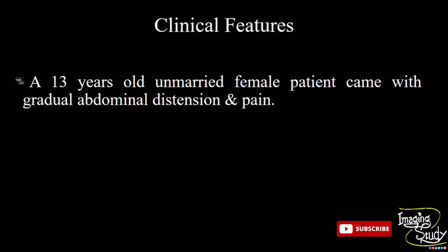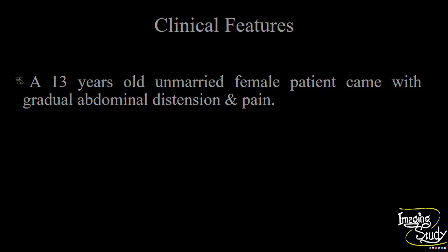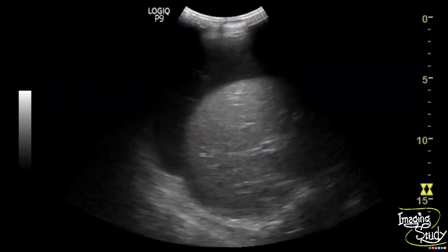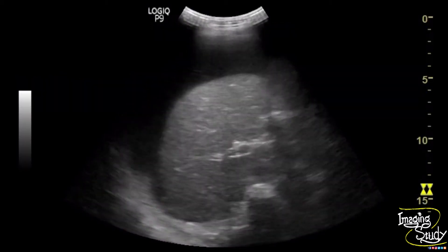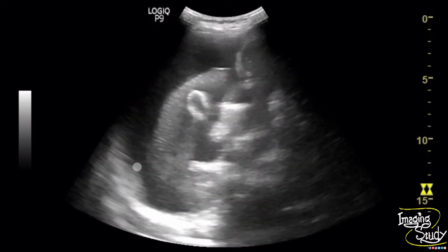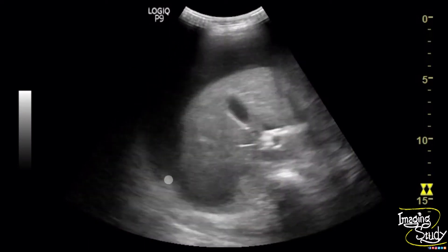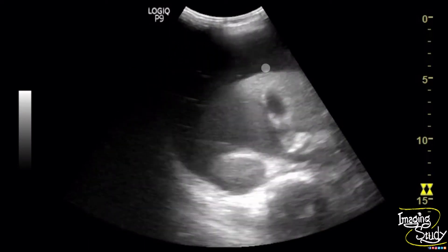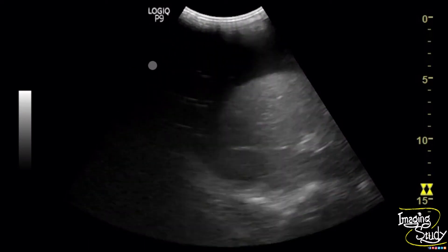A 13-year-old unmarried female patient came with gradual abdominal distension and abdominal pain. On ultrasound, you can see the right hypochondriac region shows a huge amount of peritoneal collection. The liver, gallbladder, and right kidney look normal.